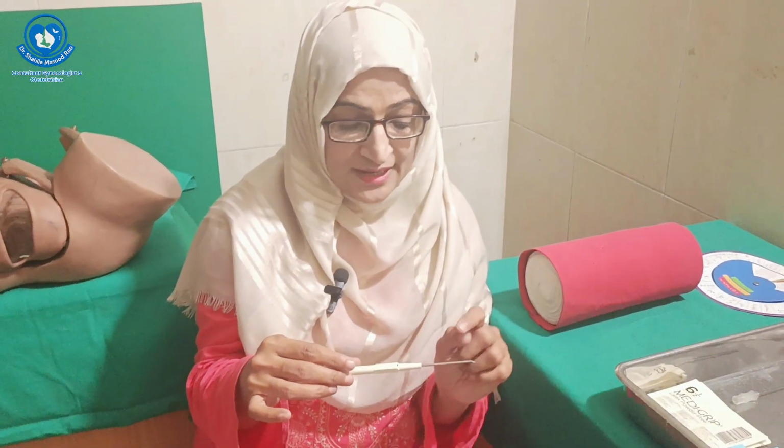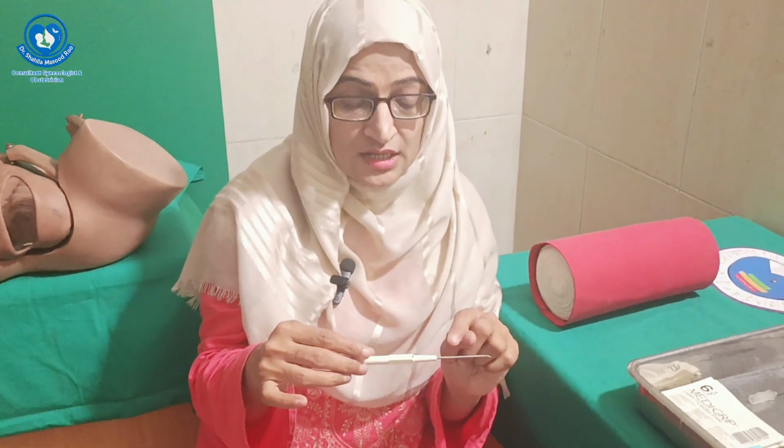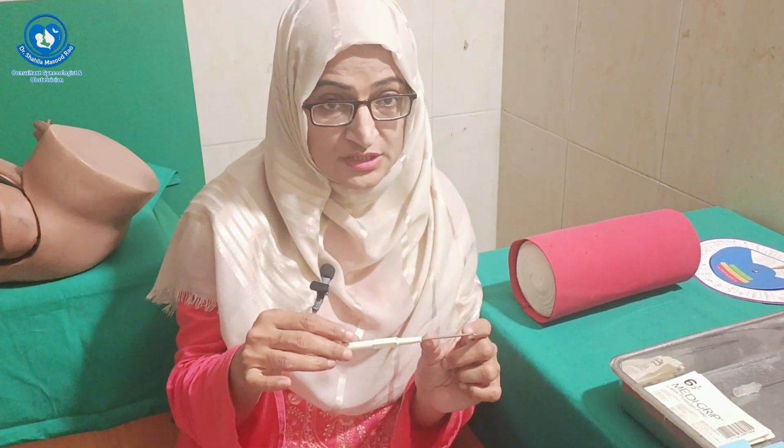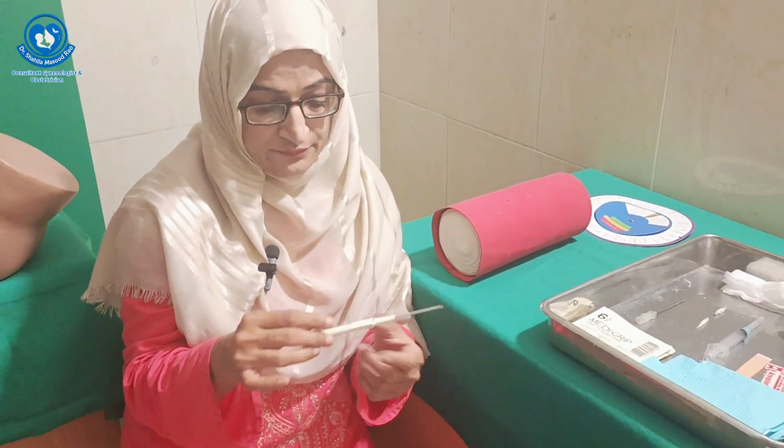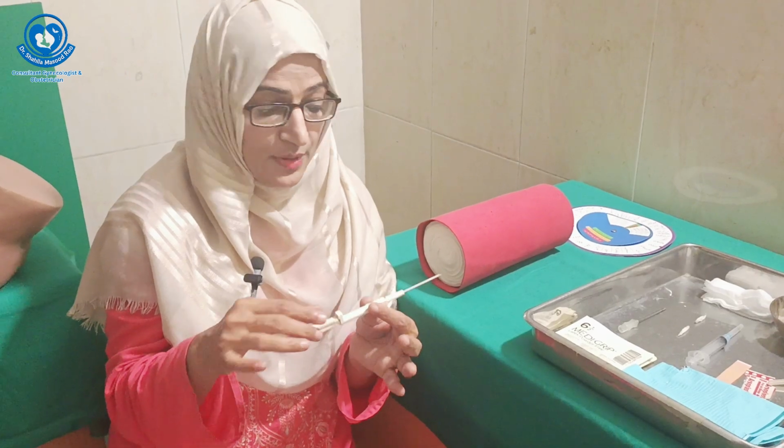This is the cannula, and the Implanon is inside the cannula, a hormonal rod of around 4 centimeters. Because it's a long-acting reversible hormonal contraceptive device, it can be removed at any time when the patient wants to conceive. So these are the parts of Implanon.